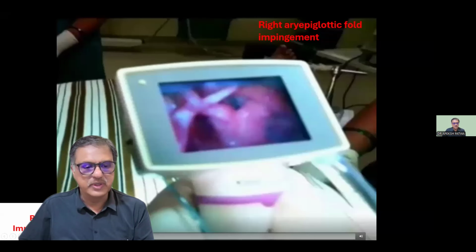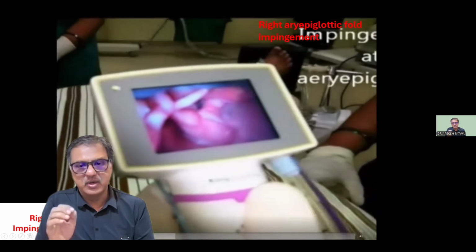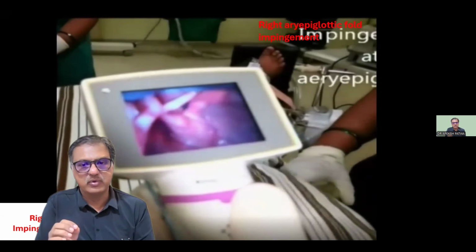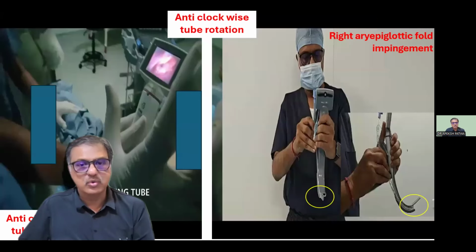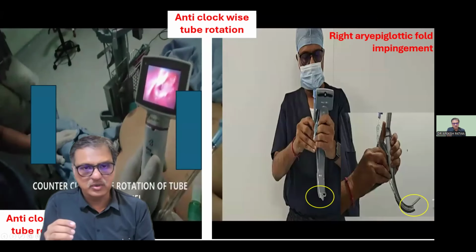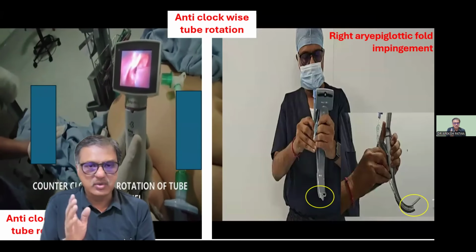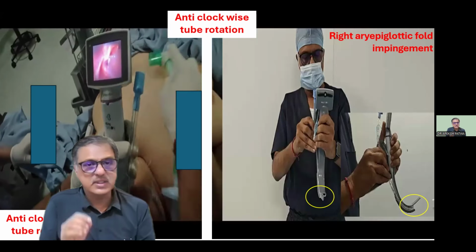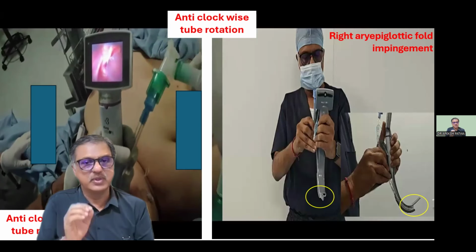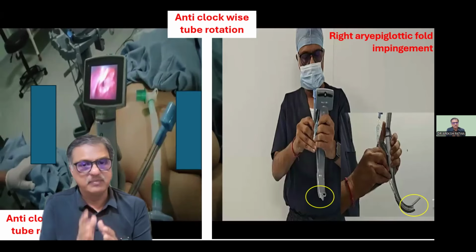So this video is showing impingement of the endotracheal tube with the channel blade over the right aryepiglottic fold. So how to overcome this? You have to withdraw the endotracheal tube 1 to 2 centimeters and rotate the endotracheal tube 90 degrees anti-clockwise inside the channel and then advance the tube to the larynx. This is how you can overcome the right aryepiglottic fold impingement.